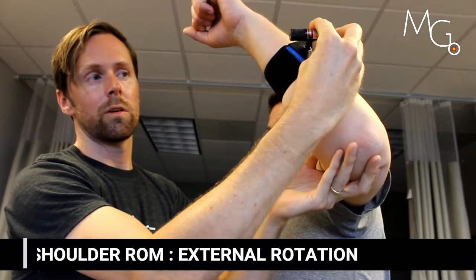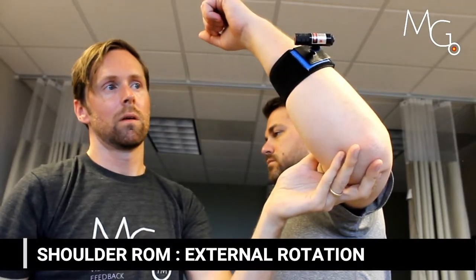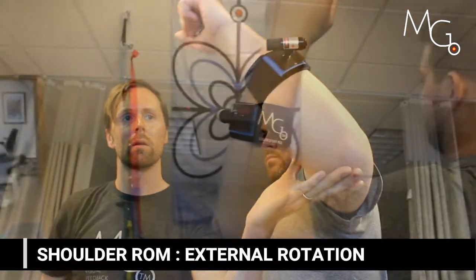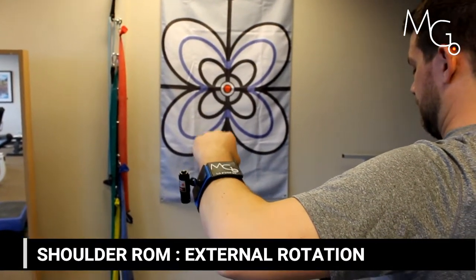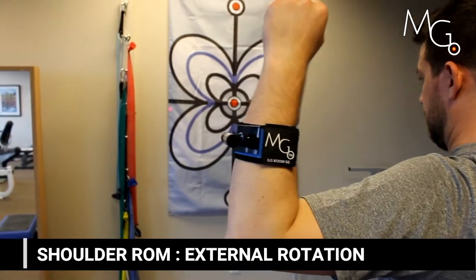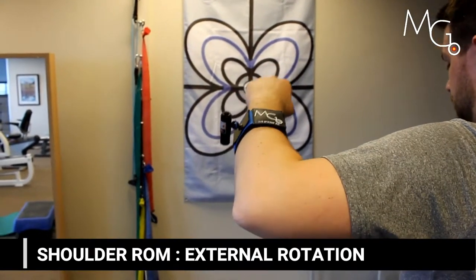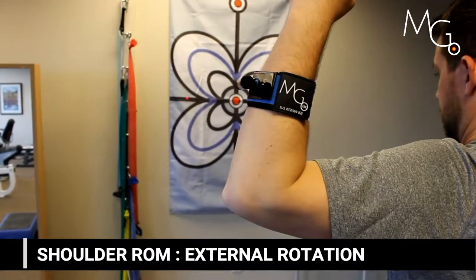You can also apply the feedback to external rotation. The guided feedback might come into use for a shoulder patient that has an instability or after a labral repair, where you only want them moving in a certain zone of external rotation. For instance, you can say move but don't go above this line.